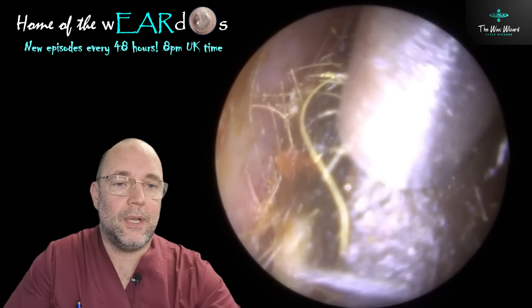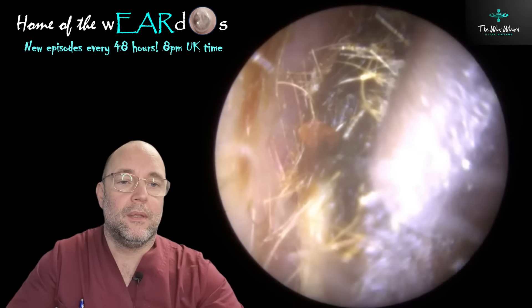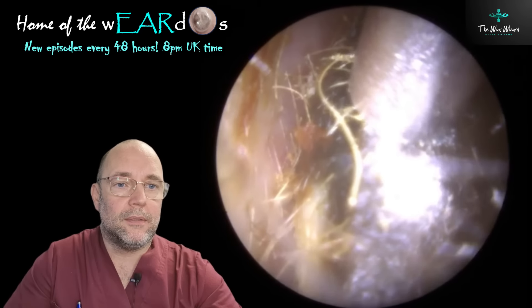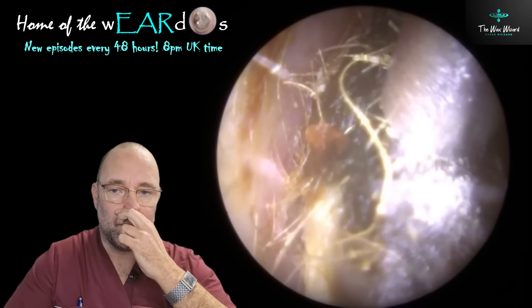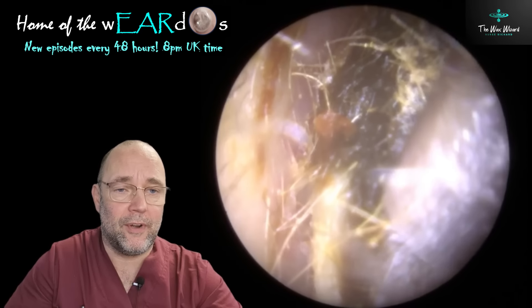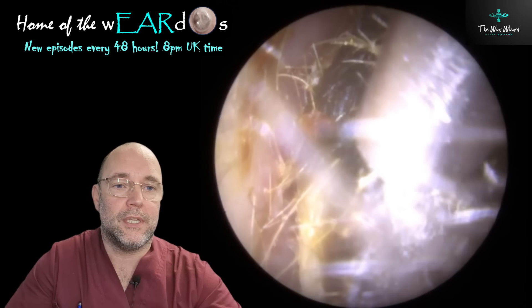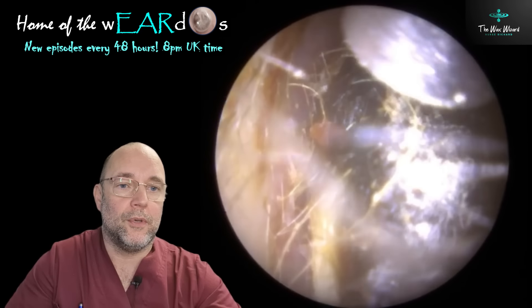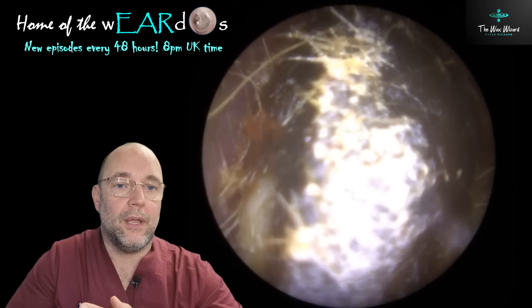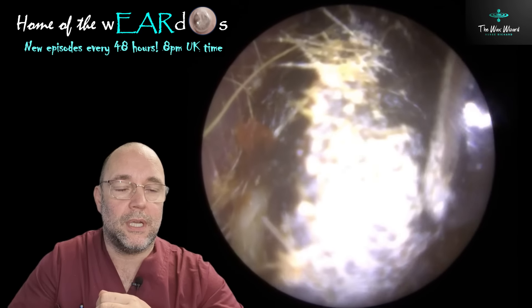I started with the suction there with a full-size tube, thinking that sometimes you get lucky. It did look quite hairy, black, quite thick and quite matte, but there was plenty of room around it, so I thought we'd have a quick go with that just to see if it could be lifted up and pulled out. It couldn't — it will become quite clear why very shortly. He could barely hear anything at all through this one, and had a constant sensation of feeling underwater, which is quite common when people get in the shower or bath — water gets trapped behind it and can't escape, making it feel even fuller.